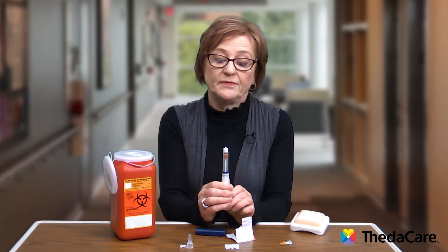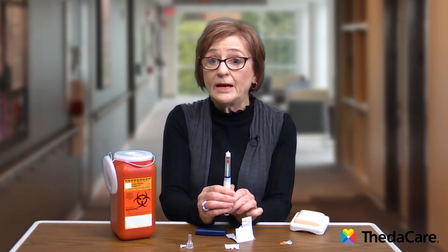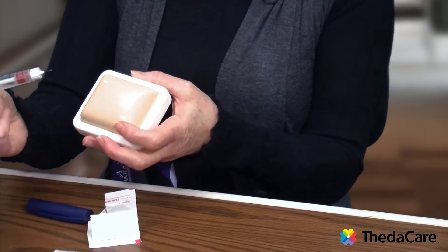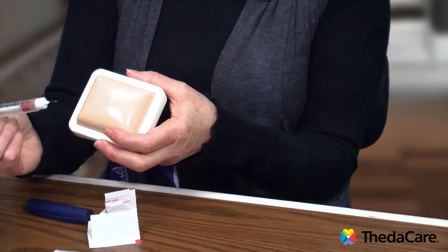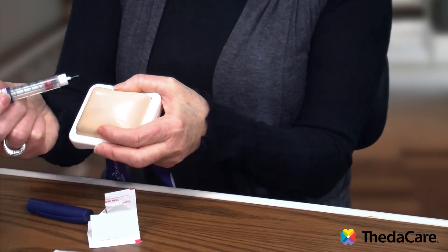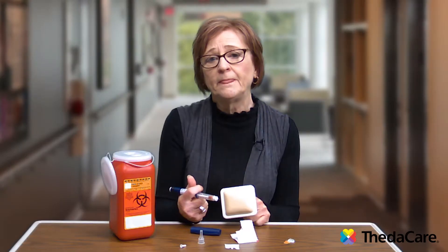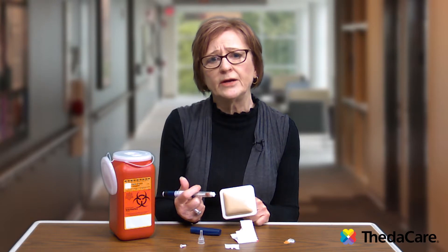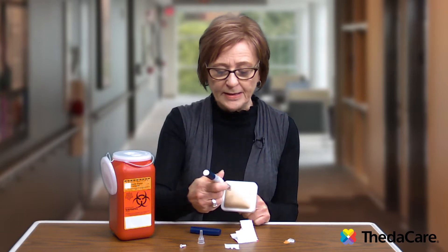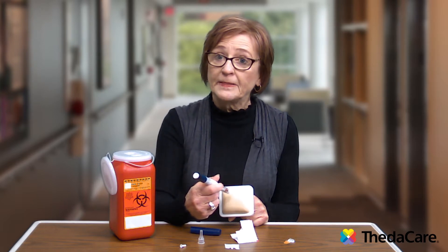To give the injection, there are different sites that are recommended. The best-absorbed site is probably the abdomen, and I'm going to use this as a demonstration. It's pretty much free reign as to where you inject in the abdominal area, but it is important to stay at least a fist away from your belly button or navel, and about one and a half to two inches away from any scars. It's also important that you rotate within that area so you're not poking the same place all the time.